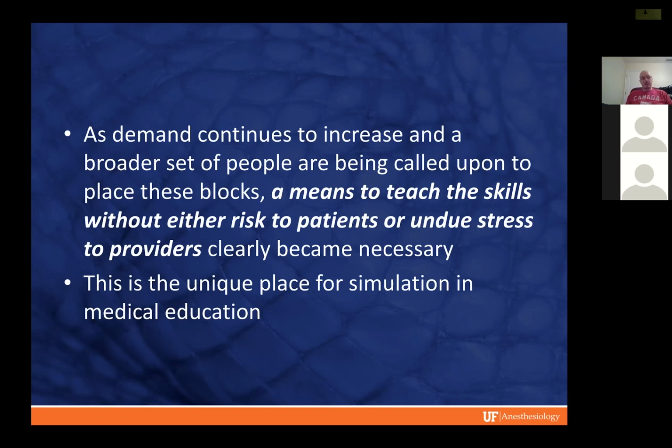And it's capable of mimicking a whole variety of normal and pathological heart sounds, and really is a very helpful tool for the cardiology world in terms of learning to interpret heart sounds. But it's a diagnostic tool. It doesn't help you with any sort of interventional thing. So if you can appreciate heart sounds that suggest to you this patient may have a pericardial effusion that is large enough, perhaps it needs draining, that simulator is not capable of letting you practice or learn how to do a pericardiocentesis. All it can do is present the heart sounds.